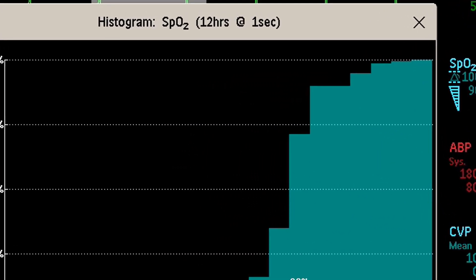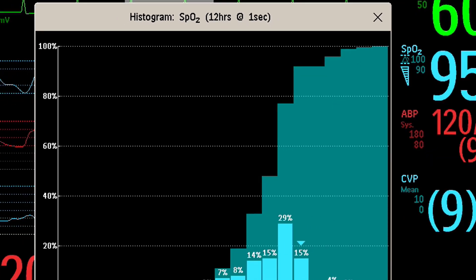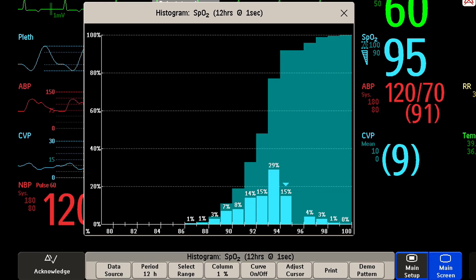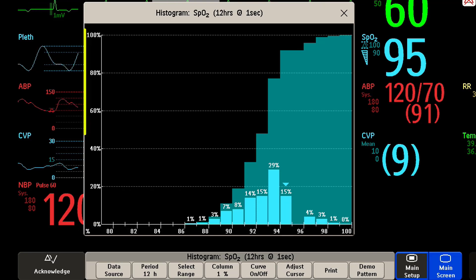In the title you can read the name of the measurement and the resolution of the data. The horizontal axis displays the range for the measurement values and the unit of measure for the parameter. The vertical axis shows the percentage of time.